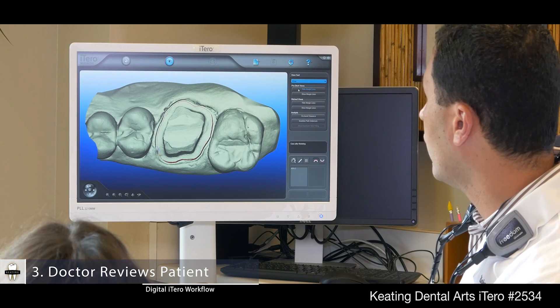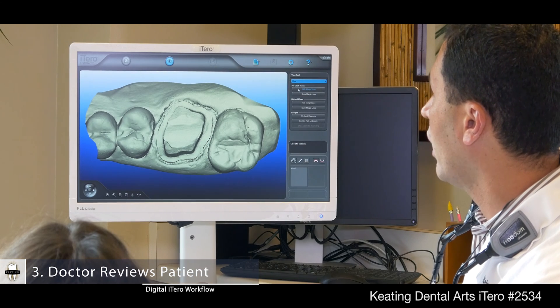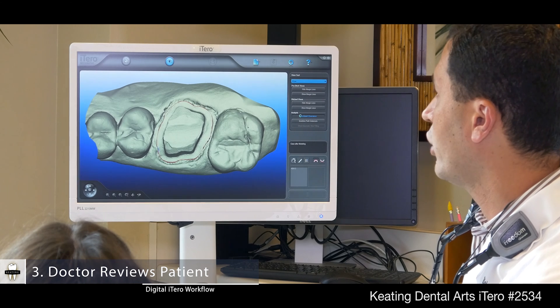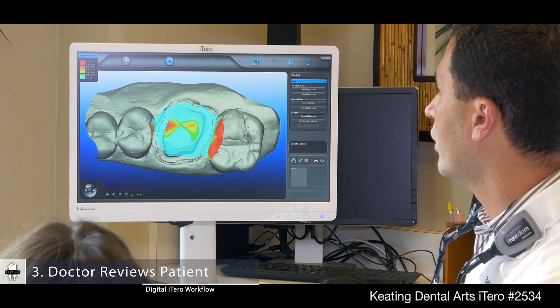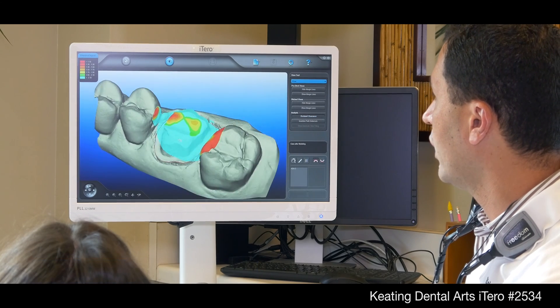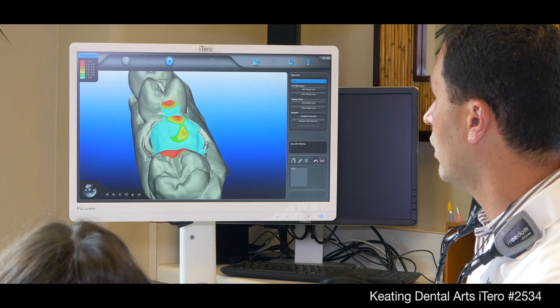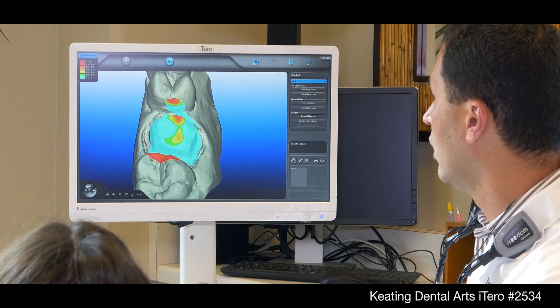You can hide the margin lines to take a look at it, you can show them, check your occlusal clearances, if you have enough clearances, mesial and distal clearances as well.